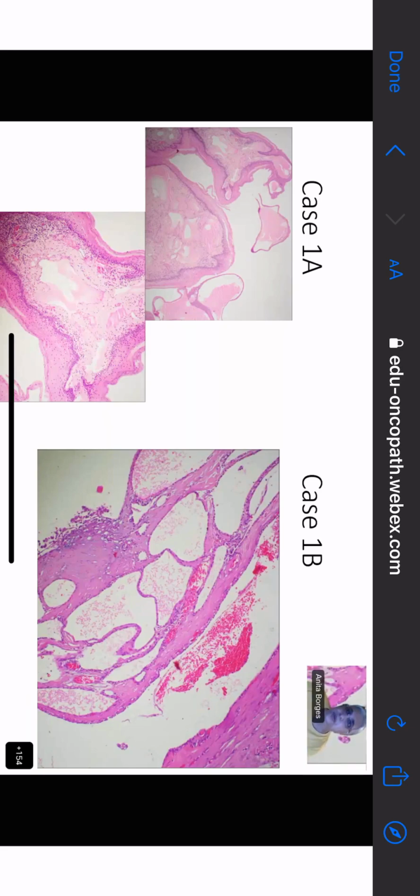So I don't know about whether Limpy is there or not, but let me start with Dia. What is a secretion? Ma'am, secretion is a content inside a space which is released by the cells lining it. Right? So you tell me what are these spaces that release these things? What are these cells that release secretions?